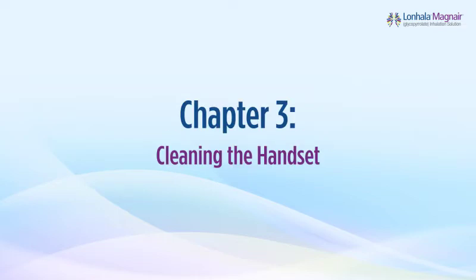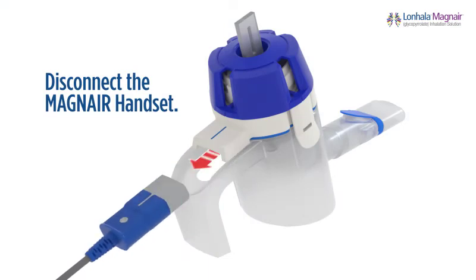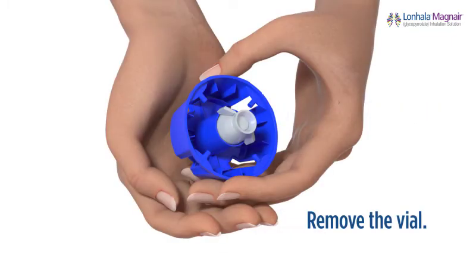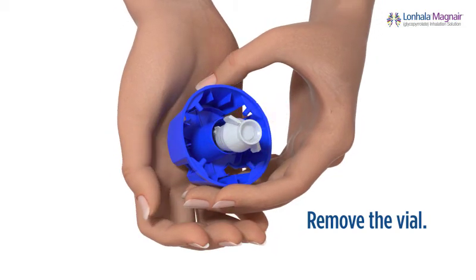This chapter reviews how to clean the handset. Clean the handset before you use it for the first time and after each use. If you do not clean the handset after every use, your treatment time could take more than three minutes. To clean the handset, disconnect it from the connection cord and turn the medication cap in a counter-clockwise direction to remove it from the handset body. If you have just taken a dose of Lanhala, remove the vial by placing the top of the medication cap in the palm of your hand and pushing up. Throw the empty vial in the wastebasket.